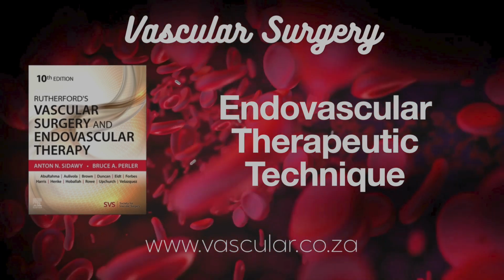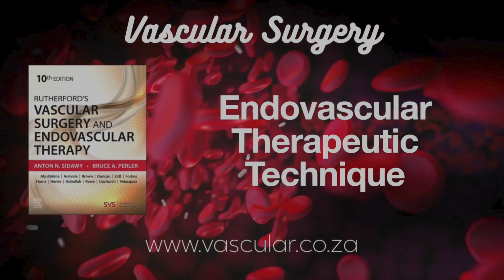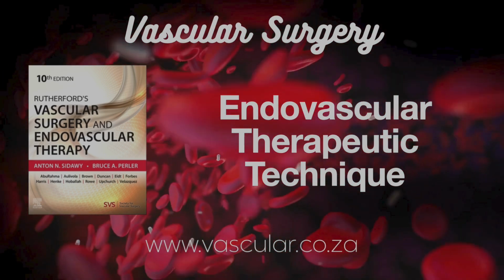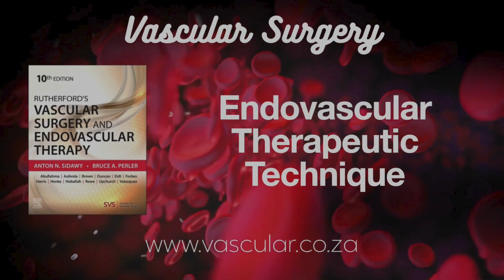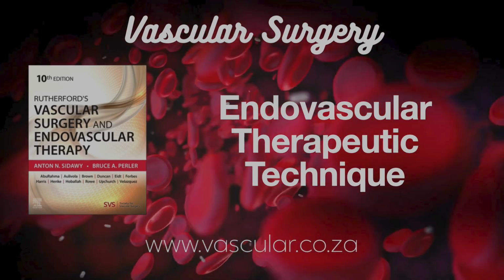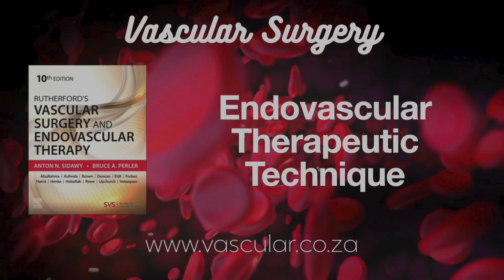And the key advantages of SES? Flexibility is a major one, much more flexible than most BES. This means better trackability, easier to navigate curvy, tortuous vessels. They're also generally more resistant to fracture from movement or external forces. Sizing is more forgiving too. Generally, yeah. And they tend to achieve good vessel wall apposition, maybe less risk of perforation. Plus, nitinol is non-ferromagnetic, so fewer MRI artifacts, which is good for follow-up imaging. Their flexibility is a big plus for certain anatomical challenges.